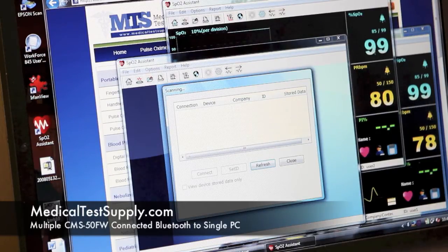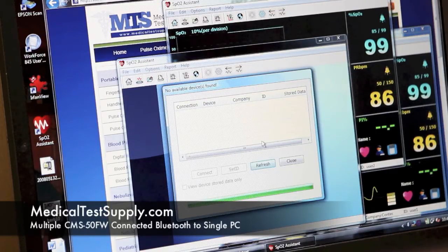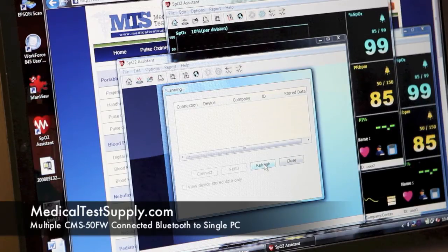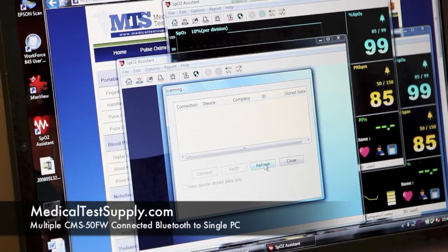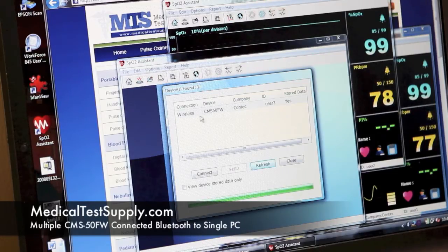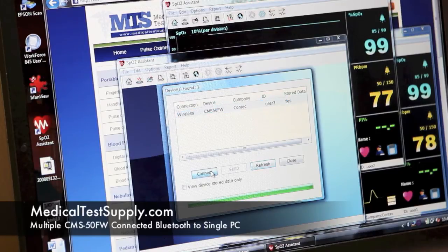First user on the right, second user still scanning to connect the third. I'm going to give it a refresh here. You can see it's found user 3 — go ahead and connect to user 3.